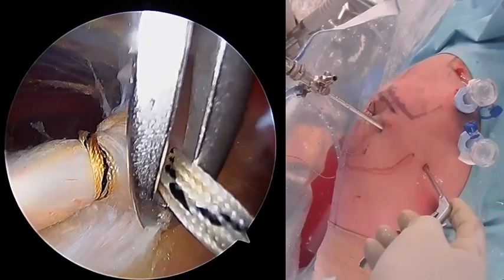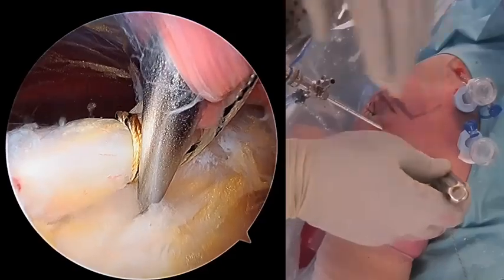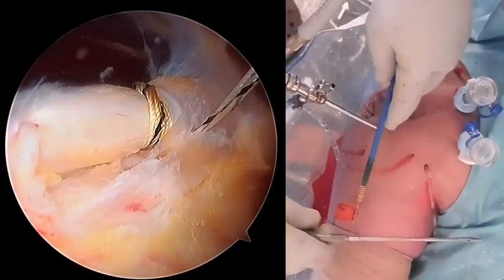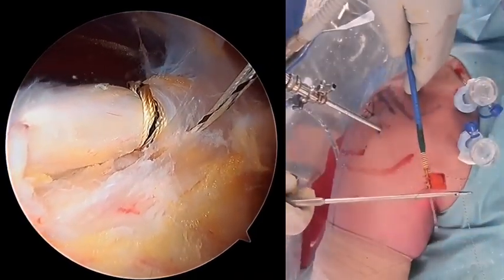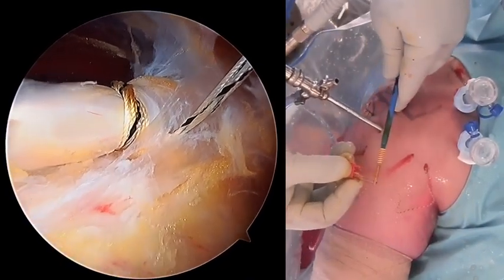We use a working port on the anterior aspect of the shoulder directly above the biceps tendon and immediately superior to the pec major insertion. The awl is used to create a hole for the swivel lock anchor. This is a 5.5mm swivel lock anchor. We prefer biocomposite anchors.